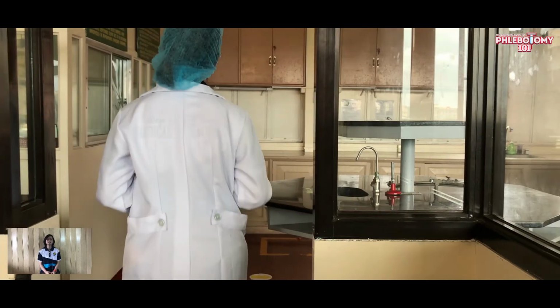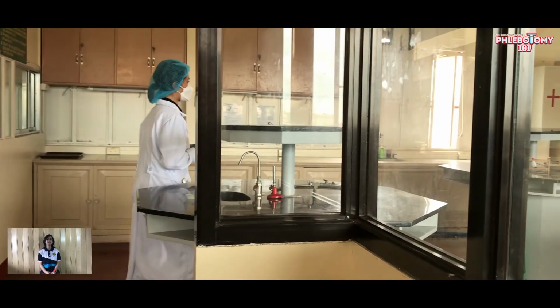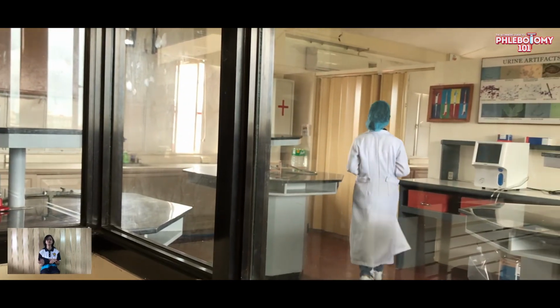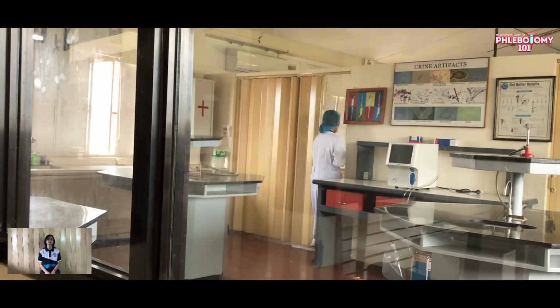And the very last step of the venipuncture procedure is to transport the specimen to the lab, kung hiwalay man ang laboratory sa blood collection site.